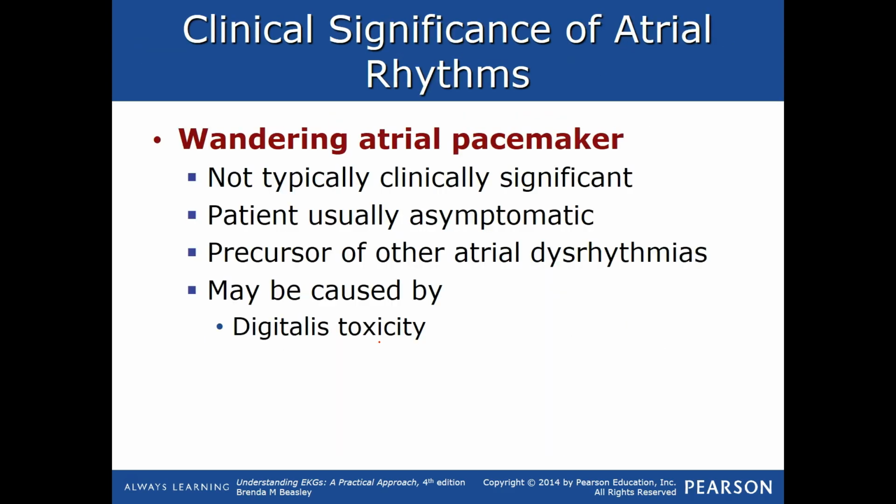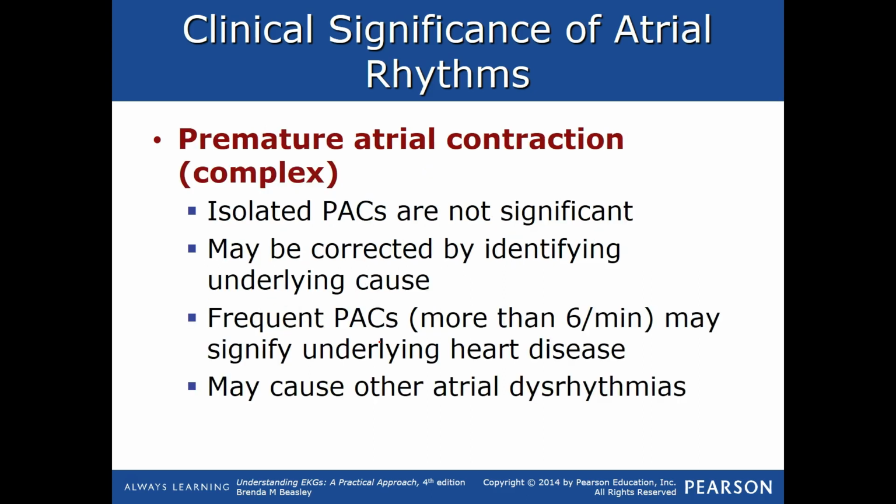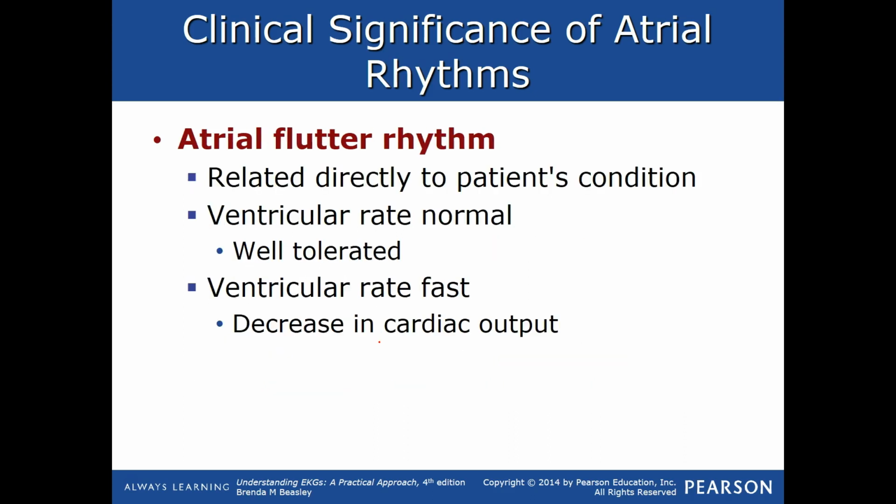So the classical or clinical significance of the atrial rhythms. Now, wandering atrial pacemaker, not much. It can be a precursor to a lot of things, but there's nothing going along with it. PACs, isolated ones are not. I've never seen anybody that had PACs that was sick, so I'll just put it that way. Frequent may signify underlying heart disease, so they might have some chronic issues going on.